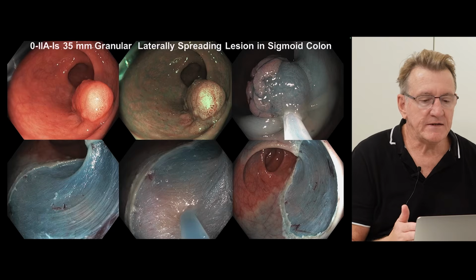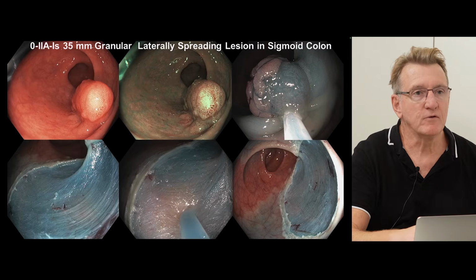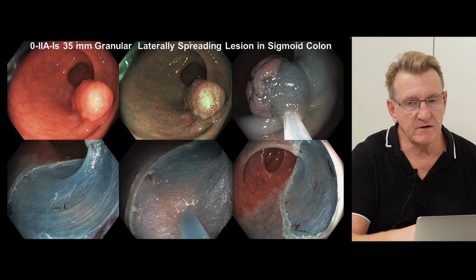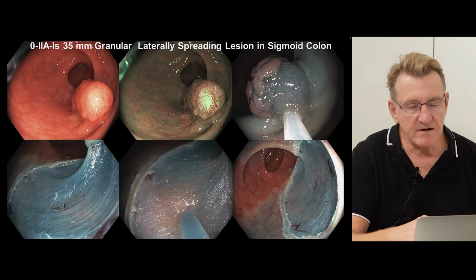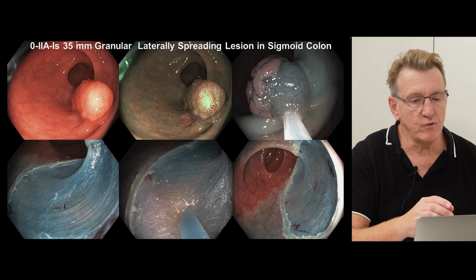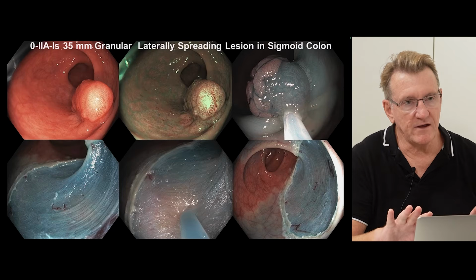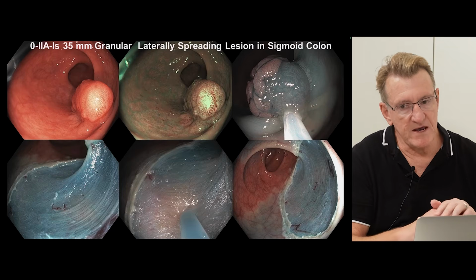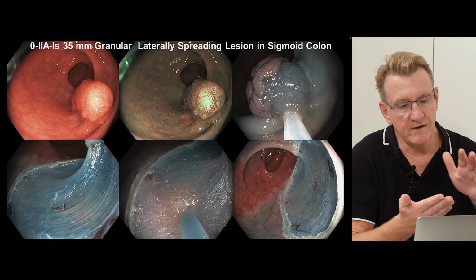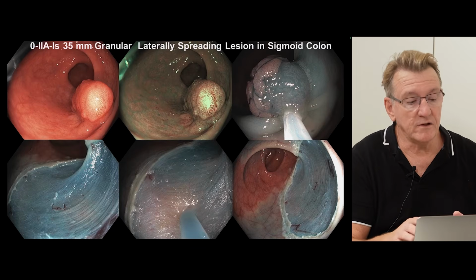If it doesn't stain, then it could be exposed muscle, or it might be submucosal fibrosis, which usually has a sort of bumpy, yellow appearance. And when you see submucosal fibrosis, that's important because that means that you cannot interrogate the muscle layer, and that there may be thermal injury to the muscle layer as a result of the adherence of the mucosa, the submucosa, and the muscle together, and there will be a risk of delayed perforation.